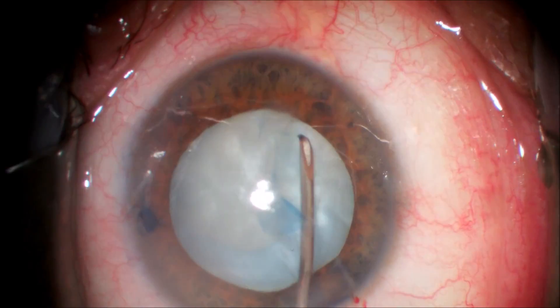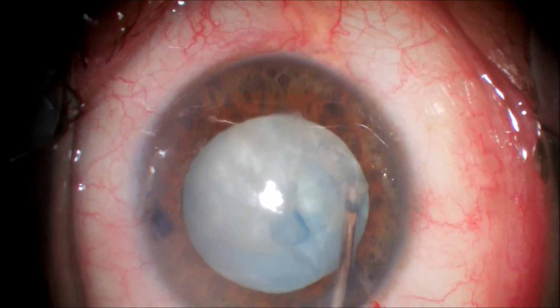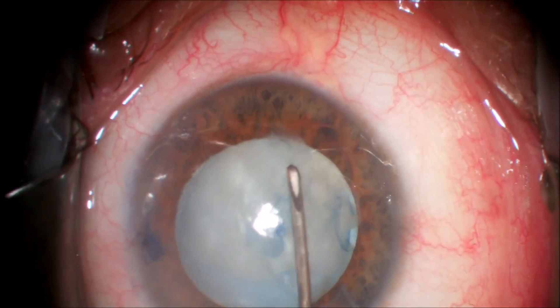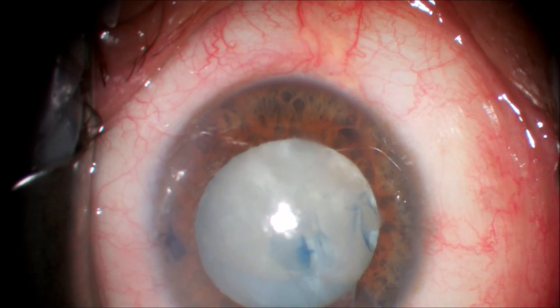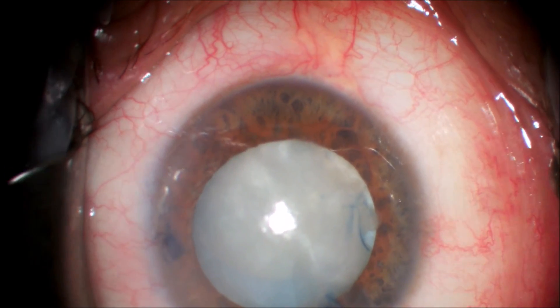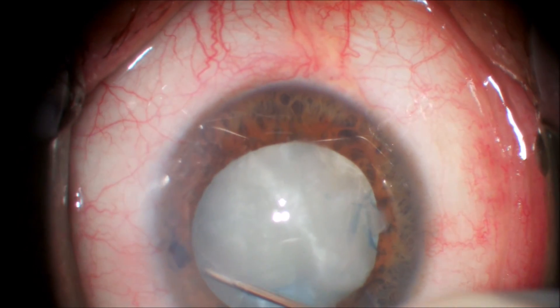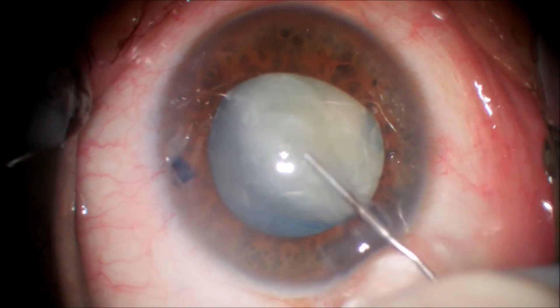In this case I decided that the capsular tear has already gone peripherally, so we use a cystitome to convert the capsulorhexis inferiorly to a can opener capsulotomy. This is what we typically use with extracapsular cataract surgery and it's easily done with a 27-gauge bent needle cystitome. We free that area of the capsulorhexis to the center of the eye and remove the anterior capsule.